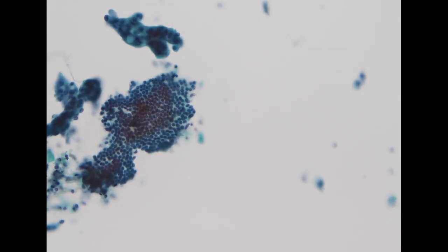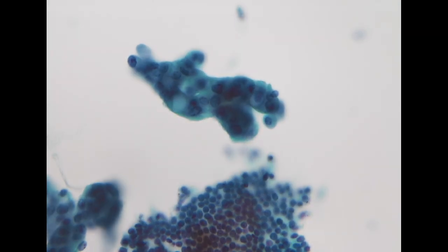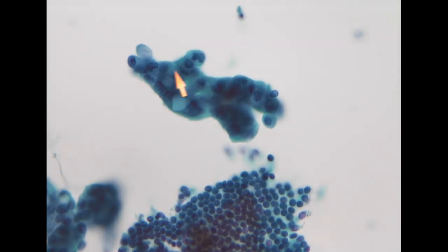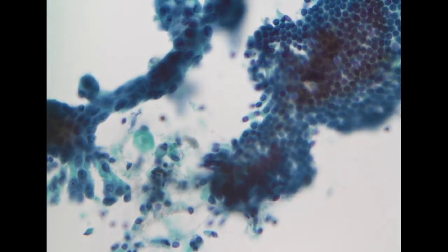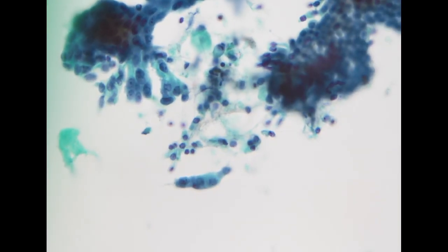And because of this low cellularity, I think the most convincing area for adeno would probably be over here. So we have more vacuolation in the cytoplasm. The nuclei seem to be very disorganized and overlapping. So I think the specimen is suspicious for adenocarcinoma.